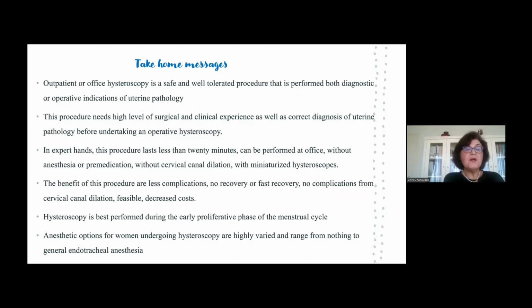Take-home message: outpatient or office hysteroscopy is a safe and well-tolerated procedure that is performed both for diagnosis and for operative indication of uterine pathology. This procedure needs a high level of surgical and clinical experience as well as correct diagnosis of uterine pathology before undertaking an operative hysteroscopy.